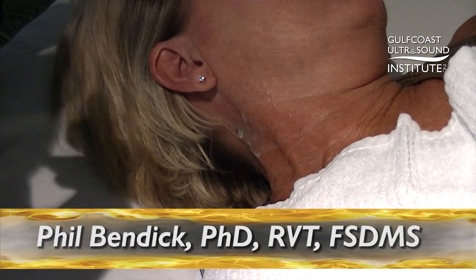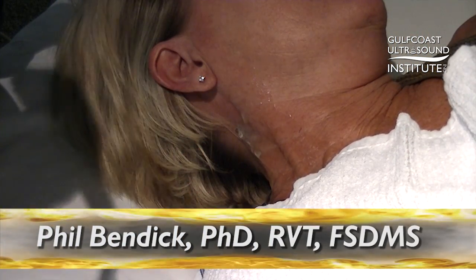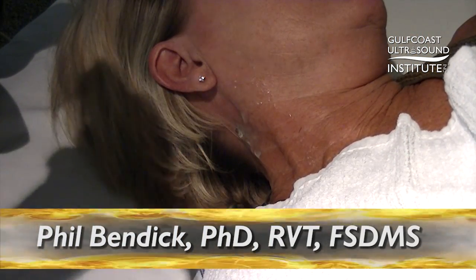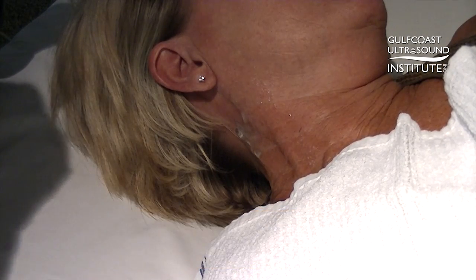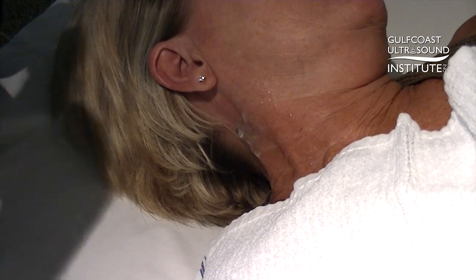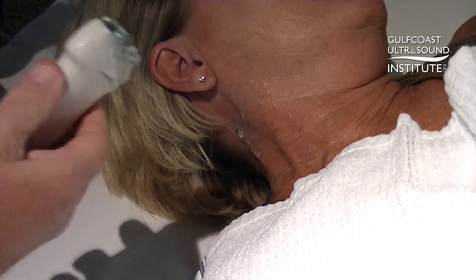Today, we just want to do a quick demonstration of finding the intima-media layer and doing a measurement of intima-media thickness with the patient lying supine.